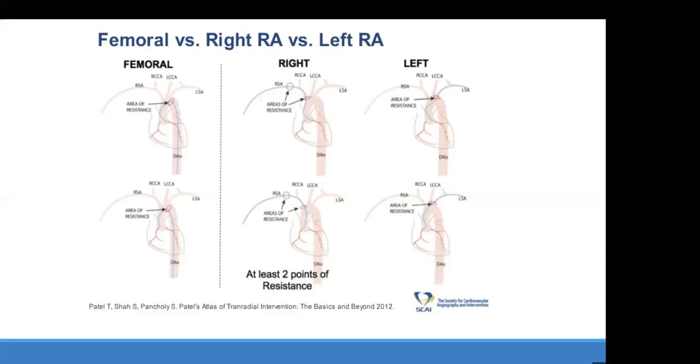What I usually do is with my left hand I torque and I transmit with my left hand. I can't explain it more here, but when you do a rotation with me I'll explain it to you.